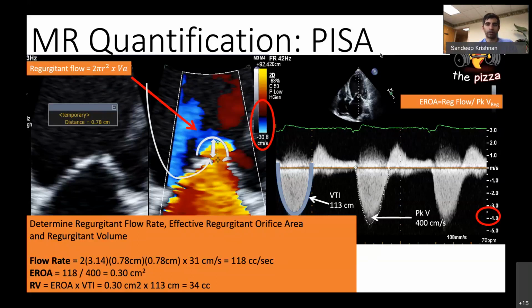It's very beautiful how much you can really tell from just sound waves. If you think about it, what you guys do is so cool, just because you can determine so much information and get so much data from a simple test that has no risk to the patient and very little cost. It's very cool how much we can tell. And you can do this test again and again and again, and it's not like a CAT scan where the patients are getting an innumerable amount of radiation.